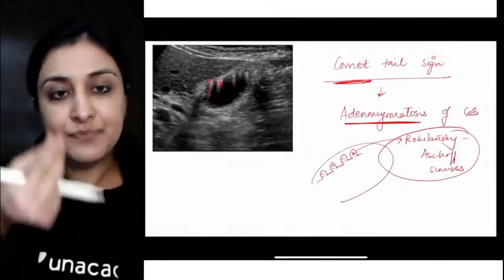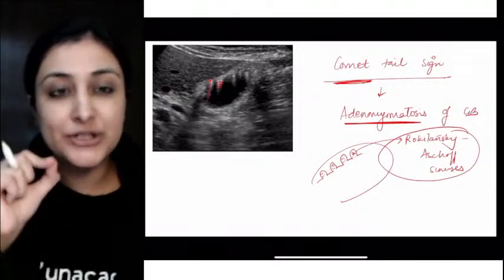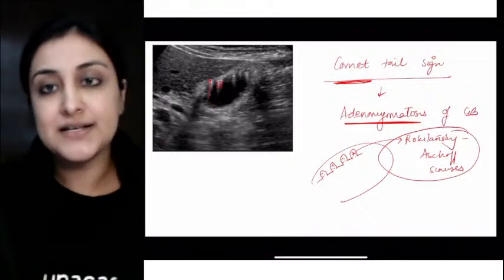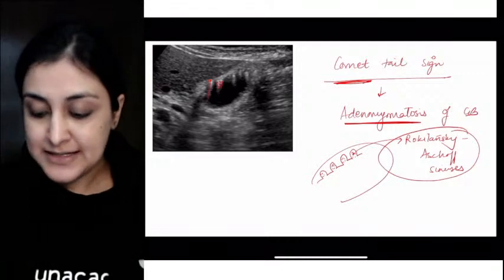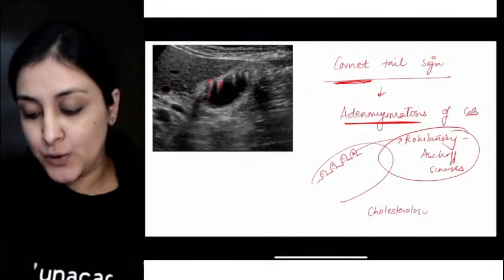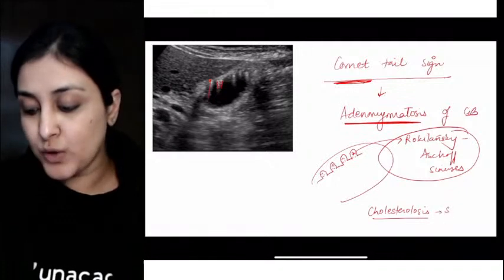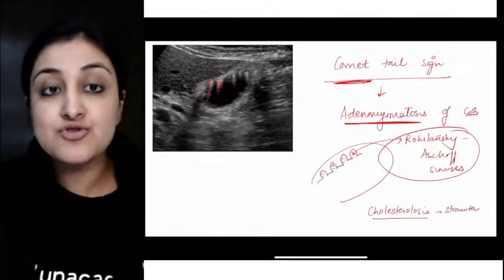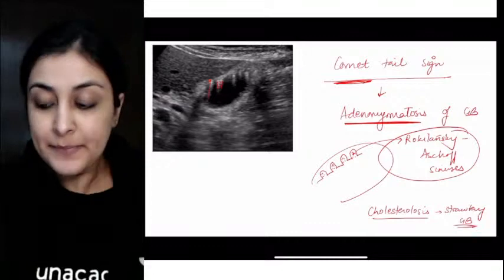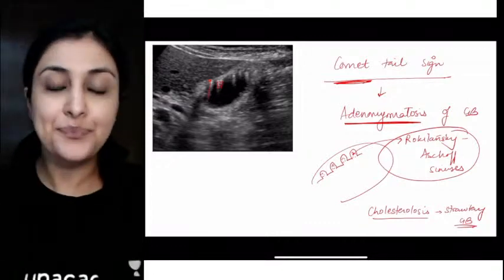These depositions of cholesterol within the Rokitansky-Aschoff sinuses in adenomyomatosis produce comet tail. From the upper wall, when you see these little lines, not like shadowing, that is comet tail adenomyomatosis. You will study cholesterolosis in this condition. This is also called strawberry gallbladder.